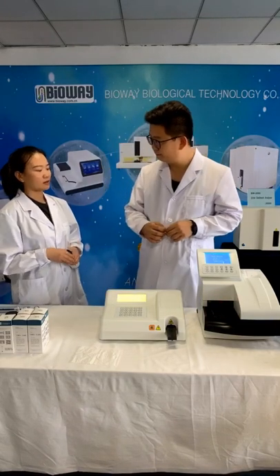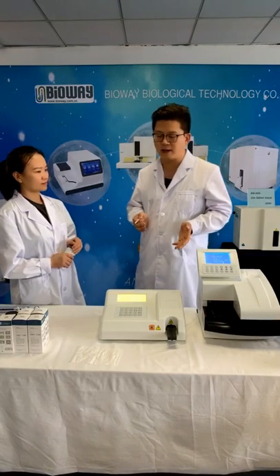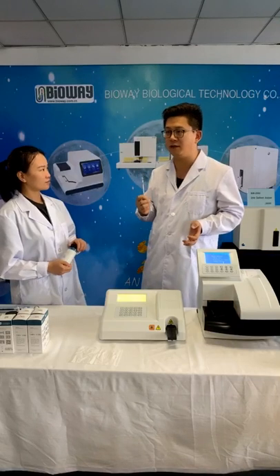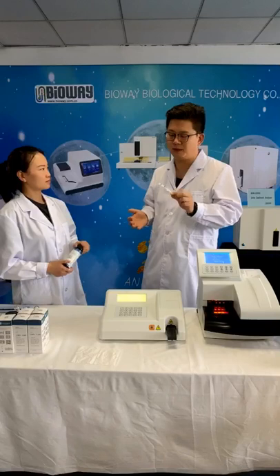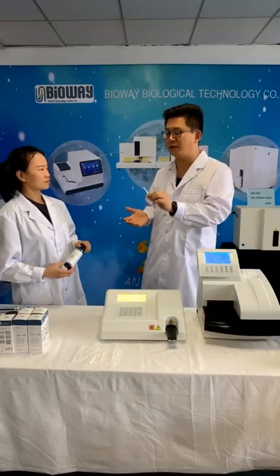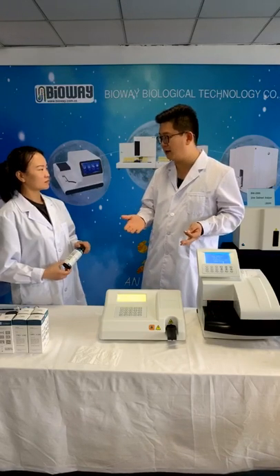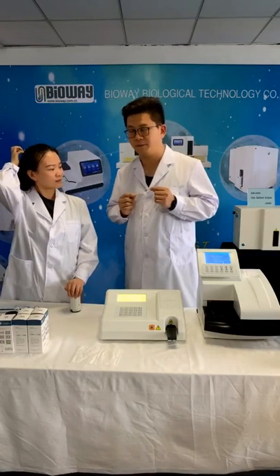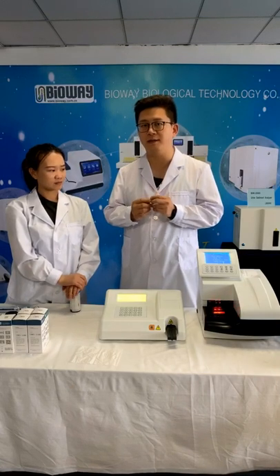So how often should we use the calibration strip? Not so often. Usually we say the devices are stable. I mean stable is there's no need to use the calibration strip every time or every single day. You can use it once a week, or after more than 1,000 tests have been done, or when you find some significant abnormal values, then you can use this calibration strip to verify if the device and the results are correct, stable, and accurate. But for a new device, I mean the first test, I suggest you use this to check that it operates well.